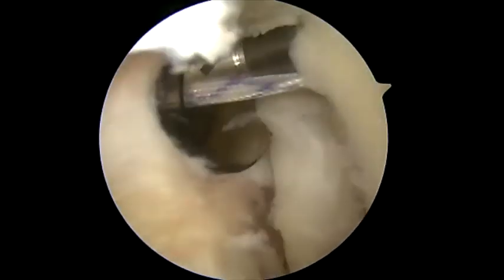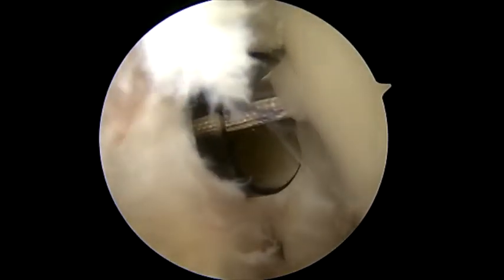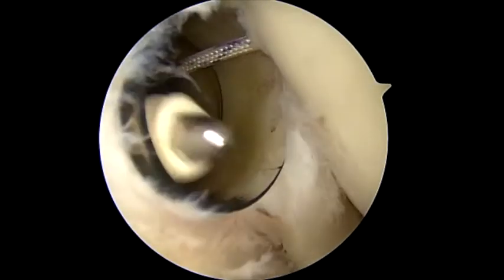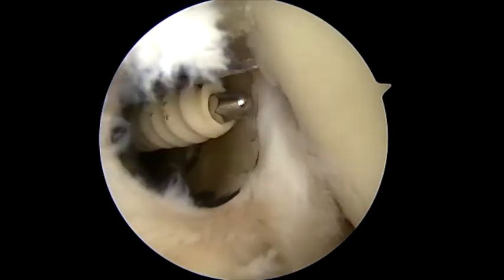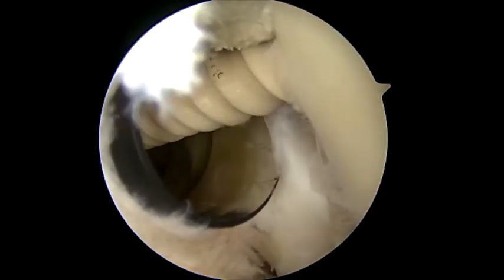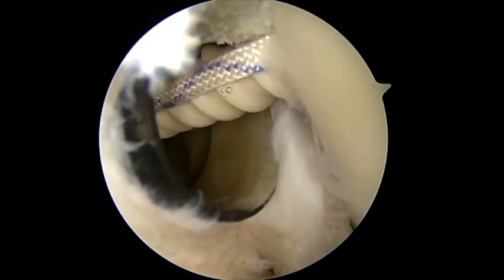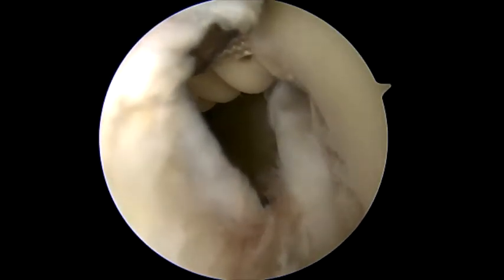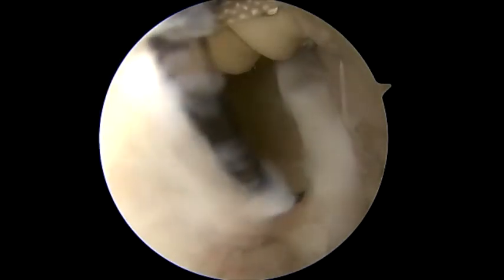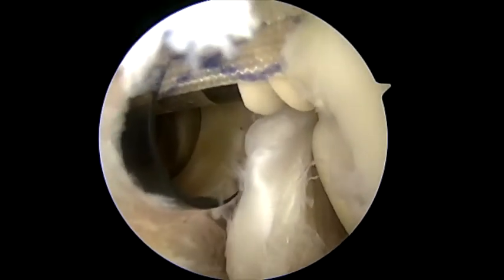Because of the asymmetrical design of the eyelet, application of tension on the sutures will seat it into the bone. Final tensioning of the tendon is done before screw insertion. Once the inserter handle is removed, you can see the sutures guide you immediately down to the hole in the bone. Because it's over the horizon, you never have direct visualization of this hole, and this guiding suture path is an extremely helpful tool for this technique. Final tensioning of the sutures to secure the tendon is done at this time, and once you are satisfied with the tension, the screw is inserted flush with the bone. The handle is then removed and the sutures are cut, completing the procedure.